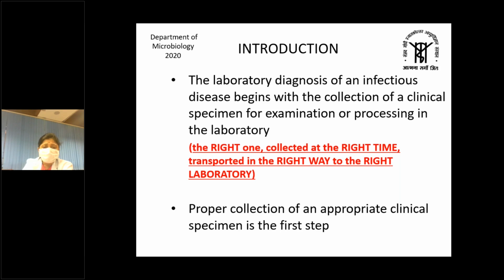The sample has to be labeled properly with the name and the registration number of the patient. It has to be collected at the appropriate time. Any delay in transport has to be avoided. It should be transported as soon as possible. In fact, it would be better within 1 hour or 30 minutes, especially with precious samples such as CSF, cerebrospinal fluid. Where the patient is very sick, a gram stain can be very useful in starting the empirical antibiotic therapy and getting an idea regarding the etiology of the meningitis or the encephalitis.